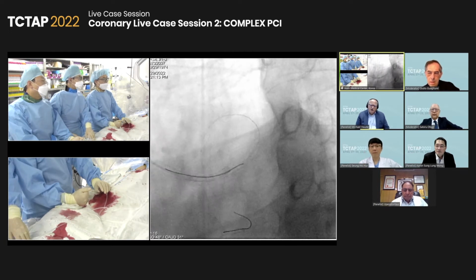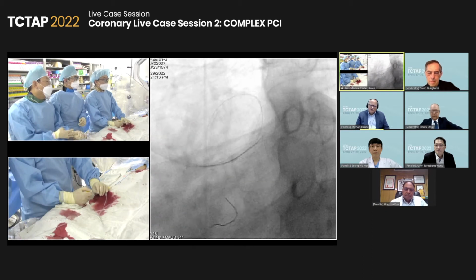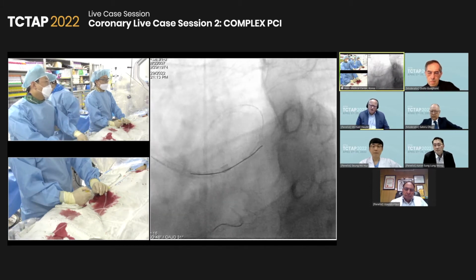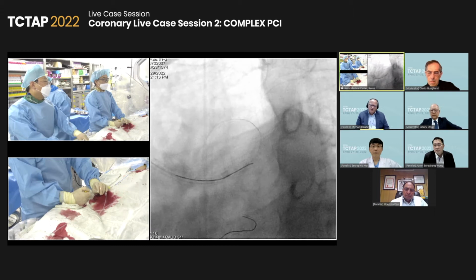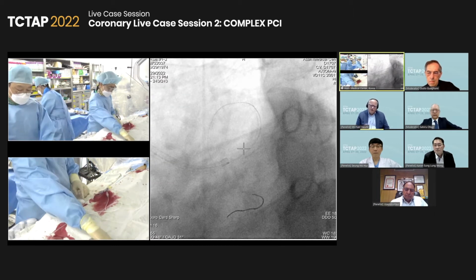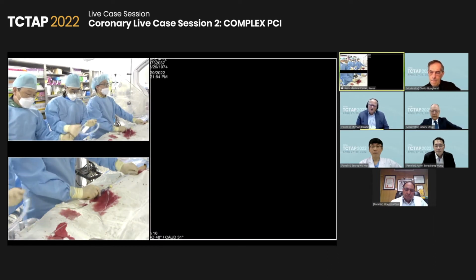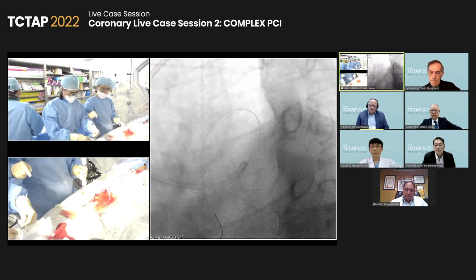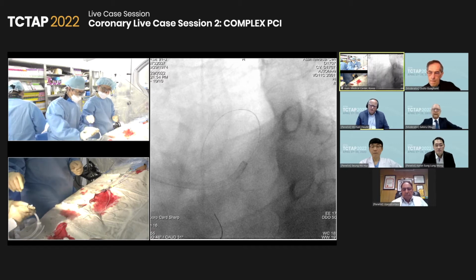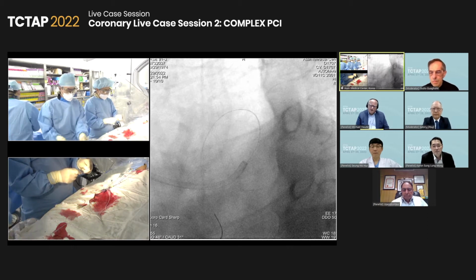Honestly speaking, the IVUS told us that the lumen size was 4.0 in the proximal LAD. So I would have selected a non-compliant 4.0 balloon for pre-dilatation. We see there is some kind of recoil. So at the end, with a 4.0, I would be happy. With a 3.5, I'm a little bit not so confident in the result that I saw. In general, I would go for a provisional strategy with a 4.0 stent right now that will receive a POT in the left main with the 5.0 balloon, that then potentially will give us a good result.